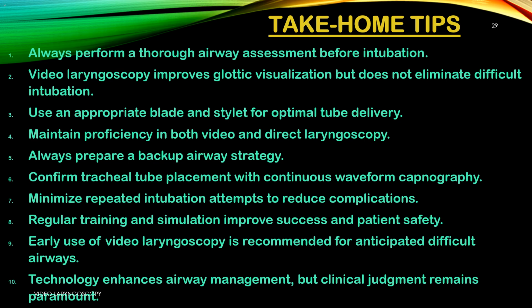9. Early use of video laryngoscopy is recommended for anticipating difficult airways. Don't wait to fail with direct first. Start with video when risk is high. 10. Technology enhances airway management, but clinical judgment remains paramount. The machine helps, but your decision-making and assessment are what keep the patient safe.